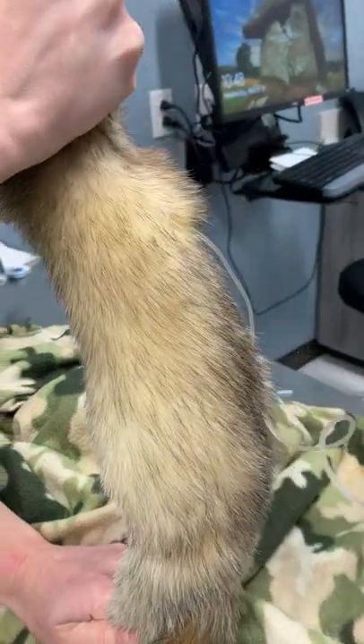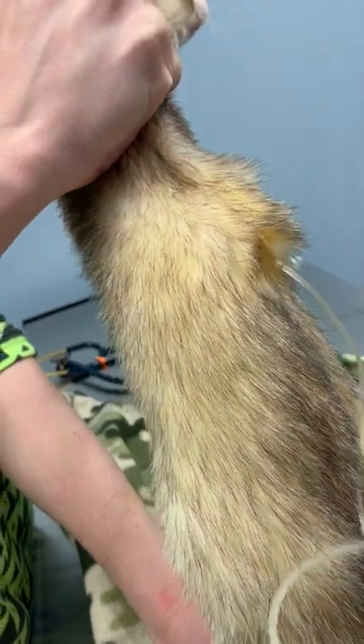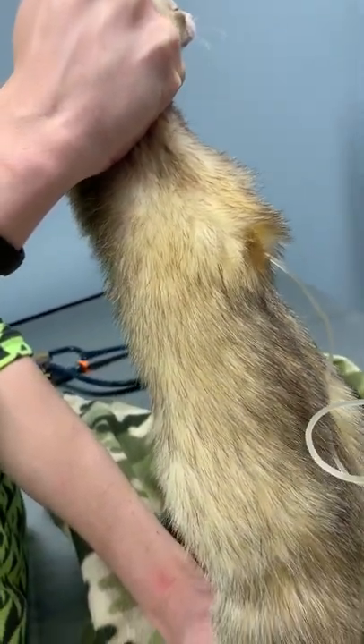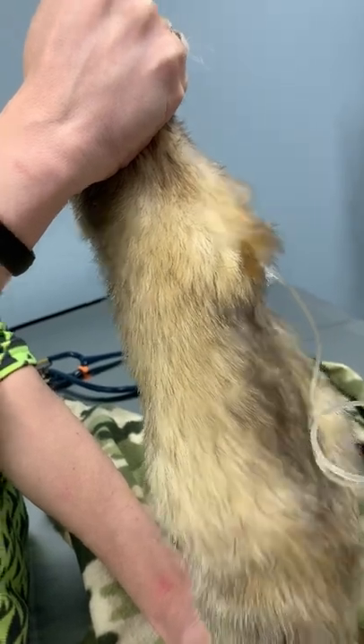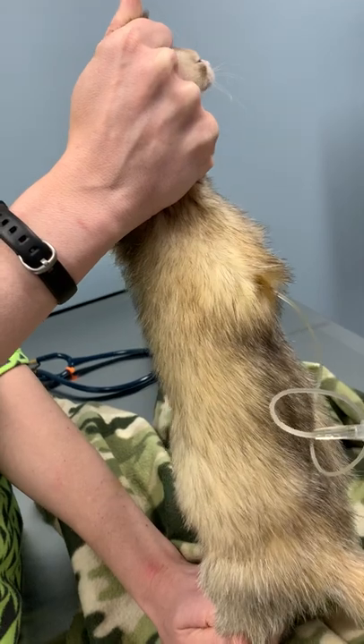So I'm just gonna push it as fast as I can with our big syringe. Sometimes it's helpful if you hold their back feet when you straighten them as well.